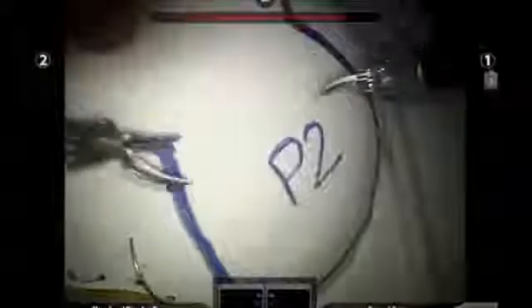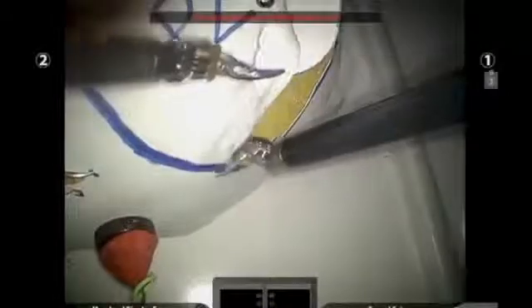Task number 6 is the Cloverleaf dissection. The learner is to cut the pattern without cutting through the underlying tissue. In the model, colored felt material is used below the latex skin layer. This exercise serves to evaluate cutting and dissecting skills as well as tissue handling. If the learner puts too much traction, the model tissue will tear.